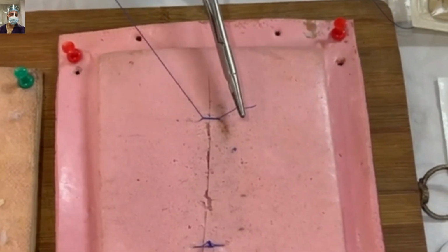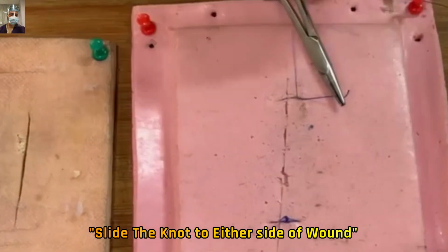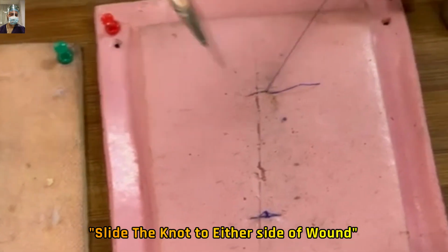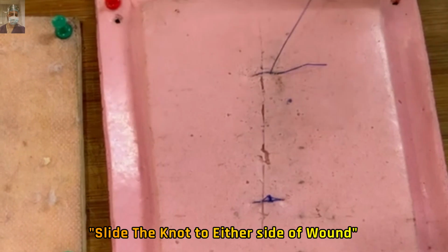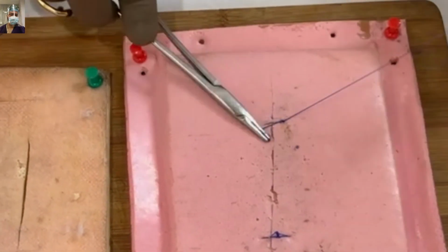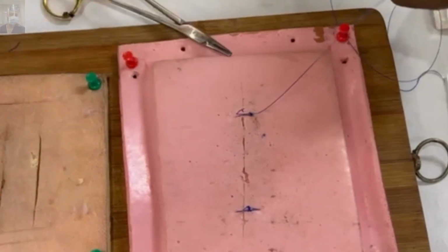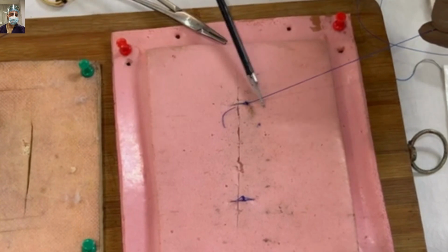Sometimes you will notice that the knots should not be on the cut edge, obviously the opposed surface. The knot should be away from the cut edge. So you can simply slide these knots to one end, and the knot will be away from the cut margin. So it basically gives lesser discomfort to the patient, lesser pain, and lesser suture mark. So you have to slide the knot to one edge.